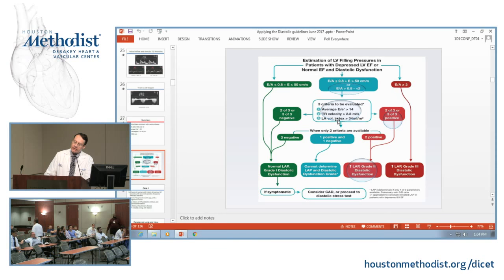Right. The pure diastologist would rather put more confidence in the diastolic velocities themselves, such as pulmonary vein, mitral, and tissue Doppler, as opposed to circumstantial evidence. But having said that, that was tested in a large multicenter study, 450 plus patients, and the accuracy is decent when you just use these two signals. But again, in the proper context, so you need to know: are you looking at a patient with heart disease or not?